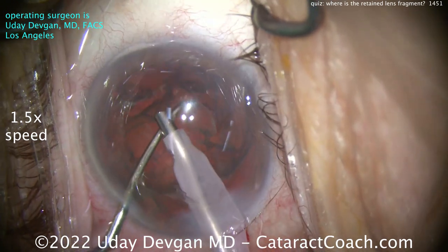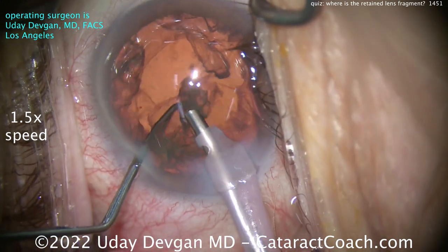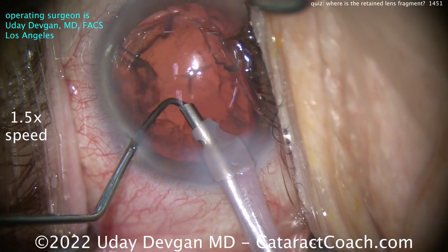Nice and easy — just barely vacuum. I want to be careful, I don't want to go through the piece with the vacuum. There it is, epinuclear shell coming up, good flow here at 40 cc's a minute. Is that the piece hiding there in the sub-incisional space? No, I got it out.